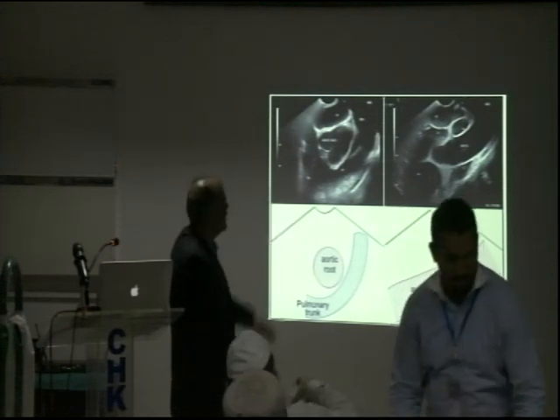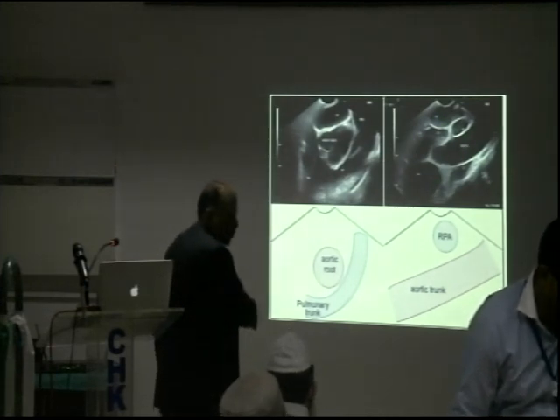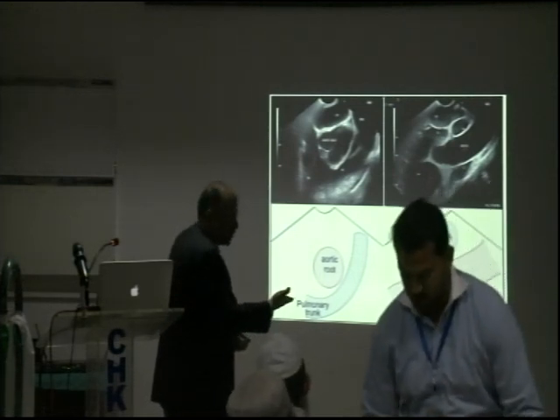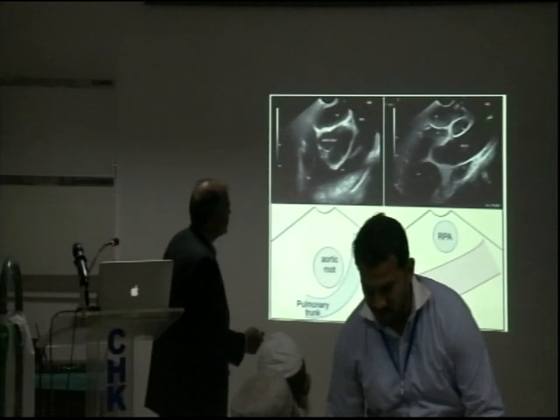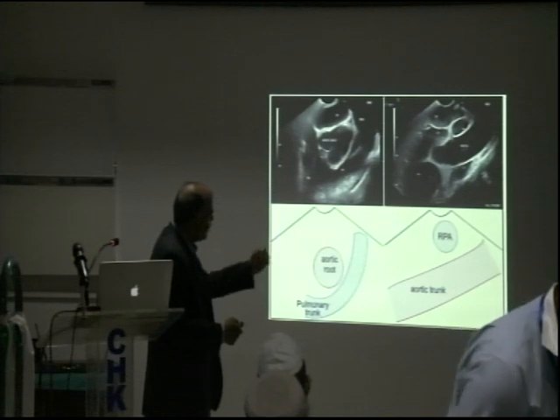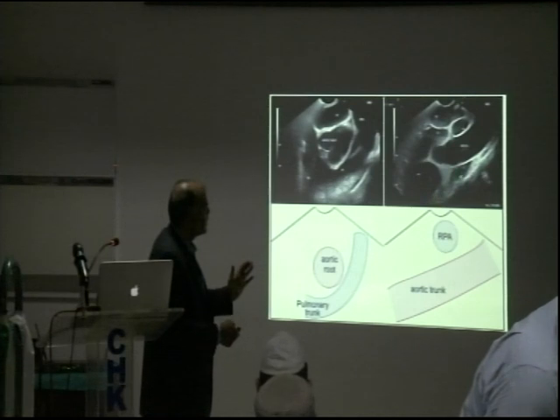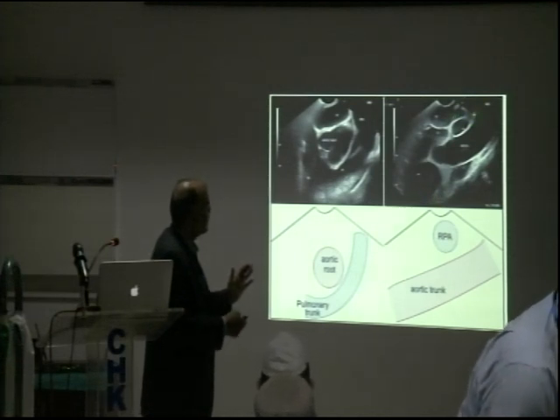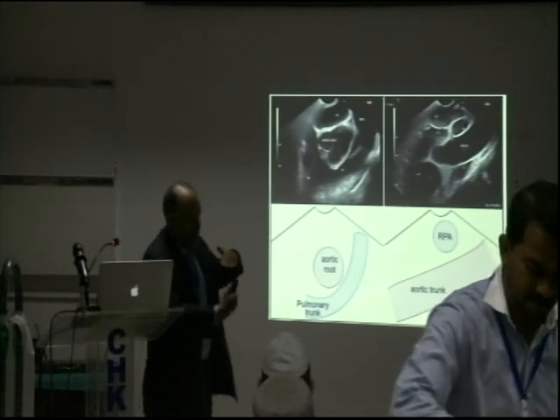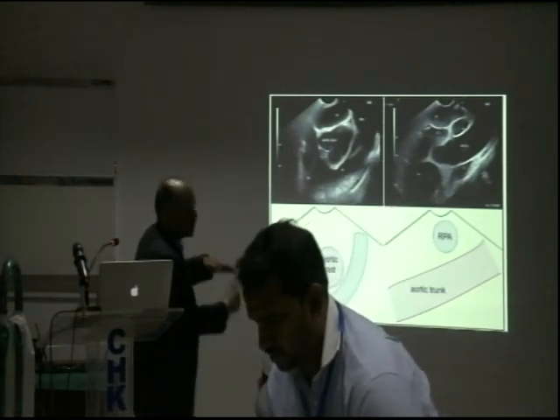Now from this position, if you go to your right, as you start moving towards your right shoulder, the scope would also rotate toward the right of the patient, right? And then you will start seeing the right side structures like the superior vena cava, the inferior vena cava, the right atrium and all this. If you start moving towards the left, you'll start seeing the left side, and if you move a little more left, you'll start seeing the pulmonary trunk. So this is important: you need to know how the scope is facing and how the patient is lying, and then you look at the anatomy, right?